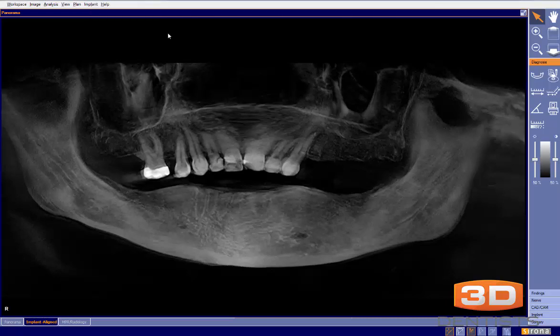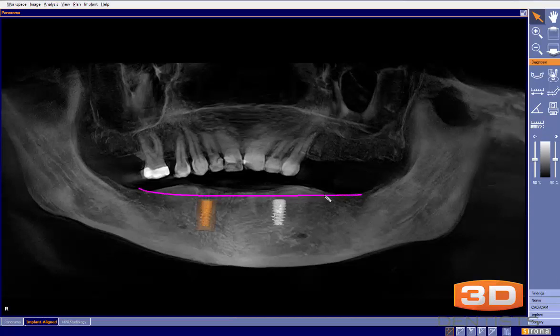For speed, I went ahead and planned a lower overdenture. In this particular case, since we do have a ridge, I plan on reducing the bone — it'll make everything easier, give us the restorative space we need, and provide a nice flat ridge so we don't have that knife edge with the implants. So keep that in mind.